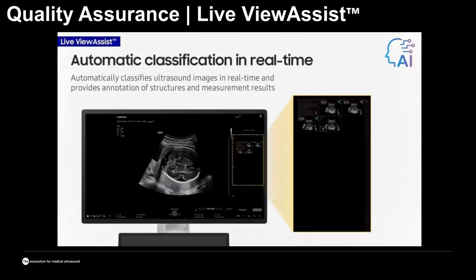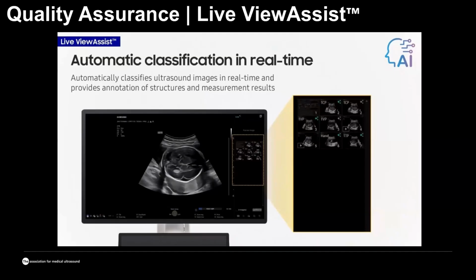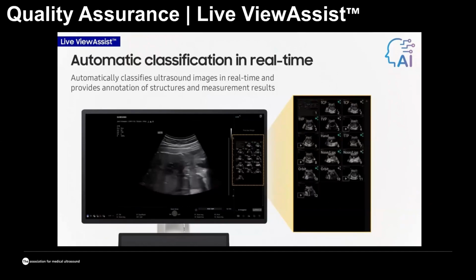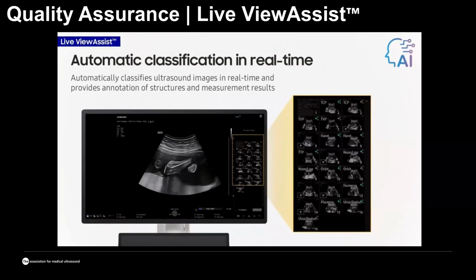But View Assist was developed even further lately, and this is due to artificial intelligence technologies that automatically label the pictures, identify what they are showing in real time, and then perform all the measurements and labeling of the structures. At the same time, it may occur without you even noticing, because that happens in the background. So you may turn it on or turn it off.